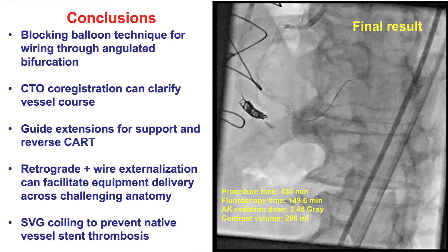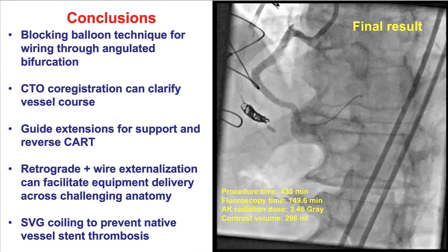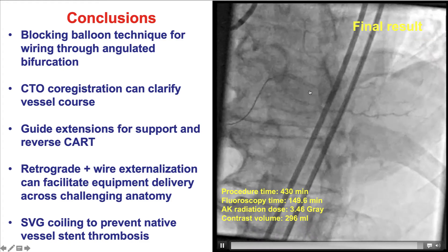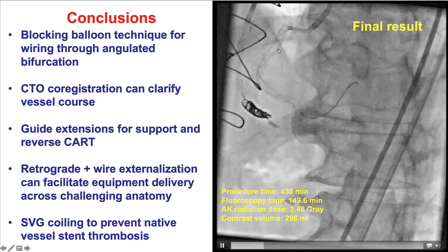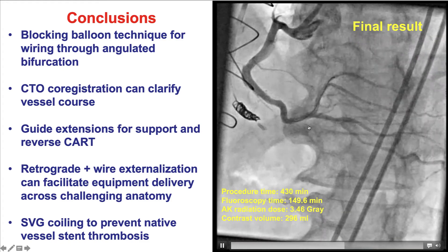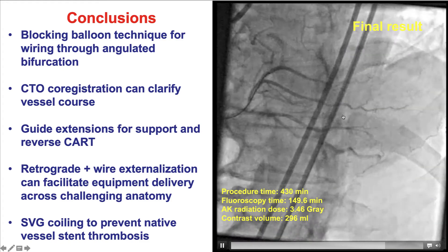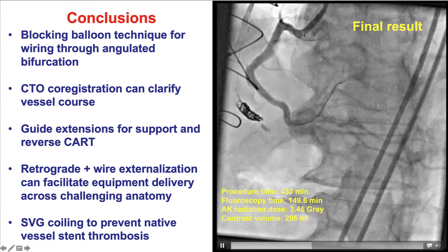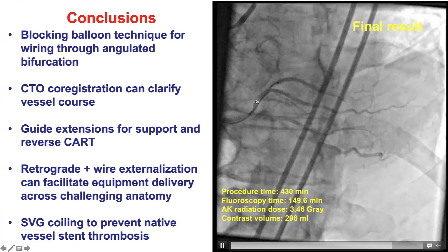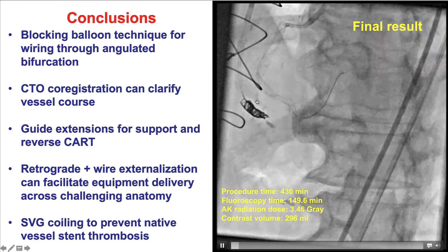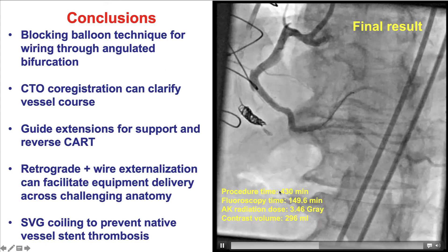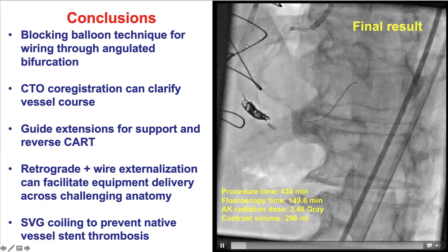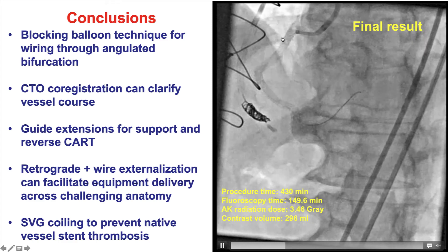We achieved a nice final result in the native right coronary artery, with TIMI flow into the right coronary posterior lateral and PDA. An excellent result was achieved despite the excessive tortuosity and calcification. This was not an easy case — it took an entire day — but we were very happy it was eventually successful.